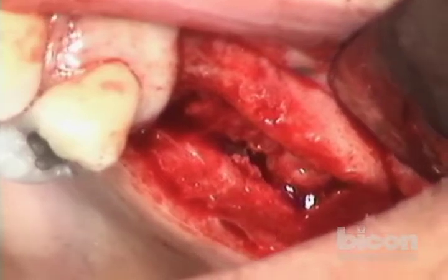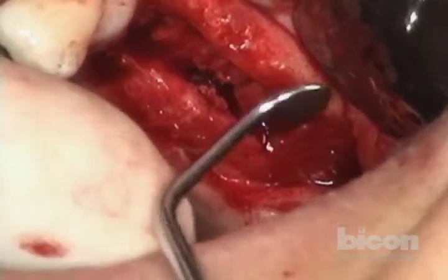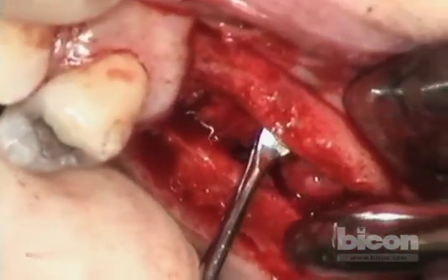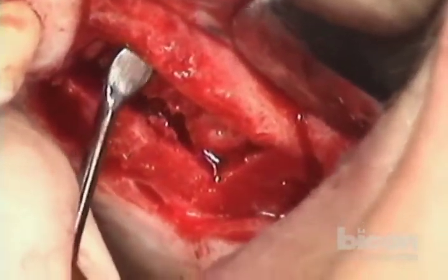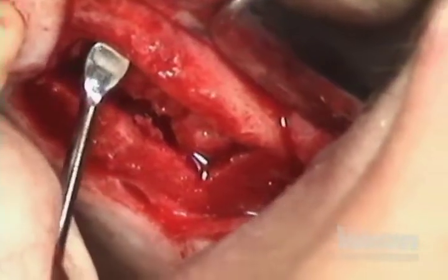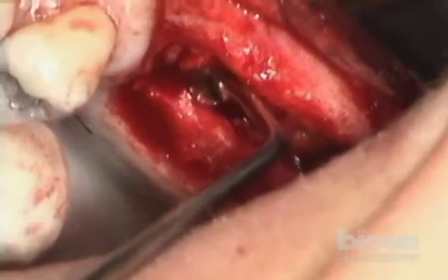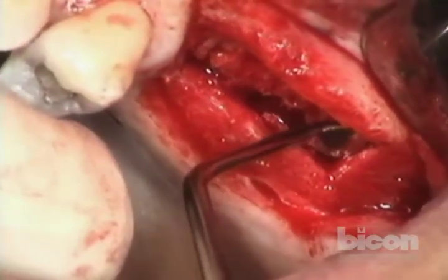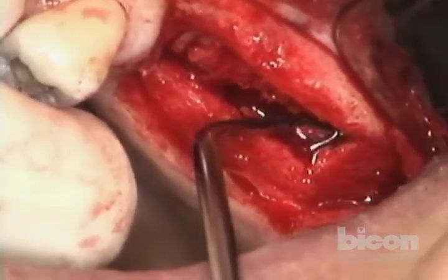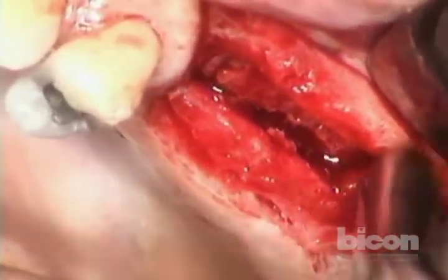Before I continue, since we've completed that, I just want to make sure that the membrane is still intact. This is a regular sinus lift curette — I'm going to make sure this is freed up, no holdups and hang-ups. That allows us to hug the floor of the sinus, mobilizing everything. I want to get the distal part freed up and cleaned up.